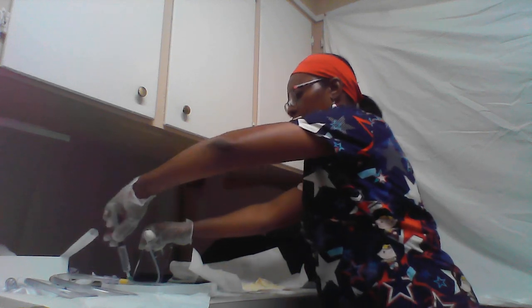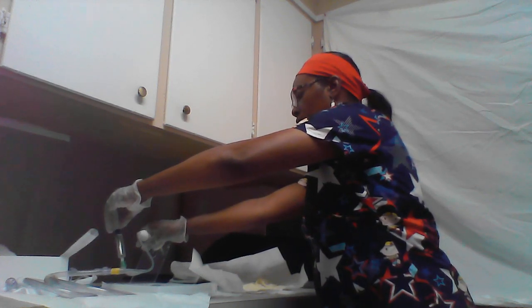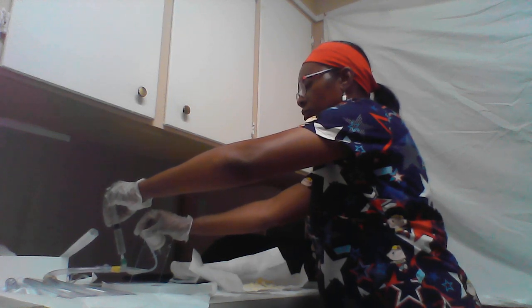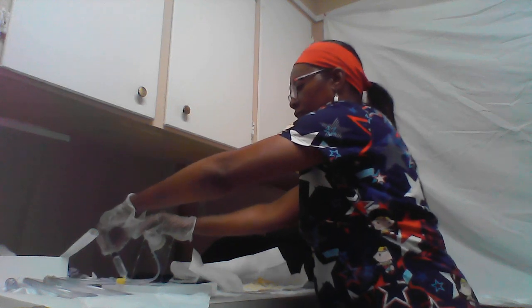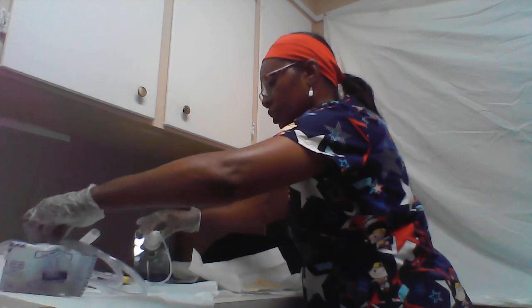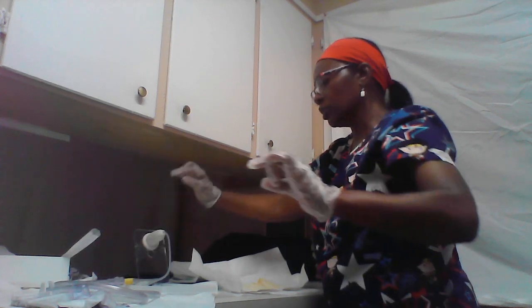and then I'm going to get the syringe and inflate the balloon, making sure that I inflate the balloon. And as I'm inflating the balloon, and then I'm going to pull back to make sure that it's in place. And then I'm going to take the syringe off and make sure that the urine is flowing without any problems.